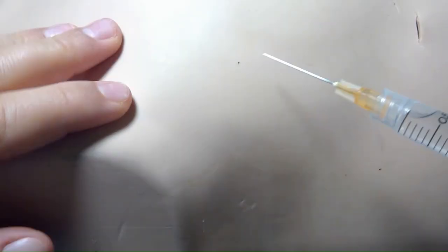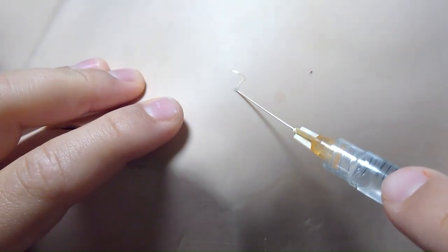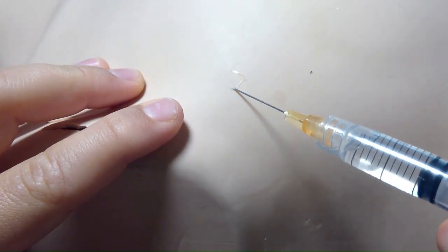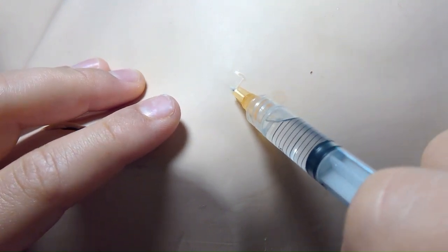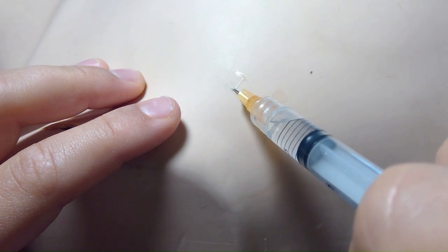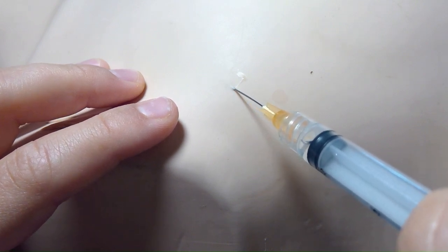This video is for educational purposes only and will not get you certified in anything. We're gonna slowly push the needle in — this is a local anesthetic — all the way, and slowly push the medication in as you're coming out. When putting in medication it will sting a little bit; the part that hurts most is when they push the medication in.